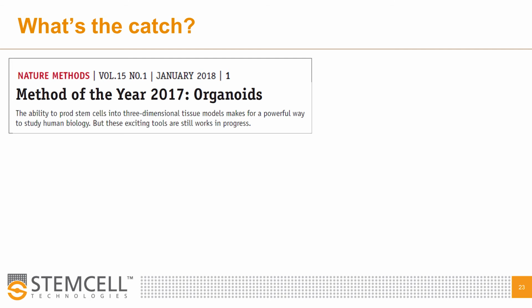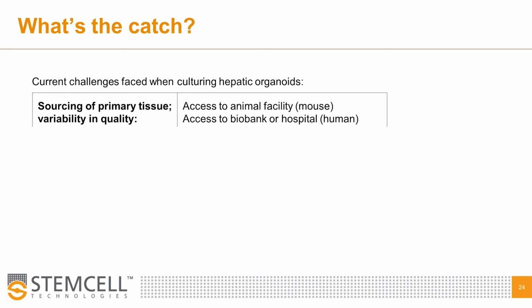So I would like to briefly outline these challenges that are currently being tackled, both in our lab and in others. So first of all, without the starting material, of course, there won't be an organoid culture. And although it is handy that once organoids are established, they can be cultured indefinitely and don't rely on further tissue supply, we have to start with some tissue.